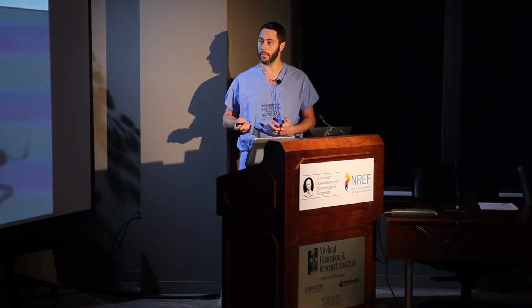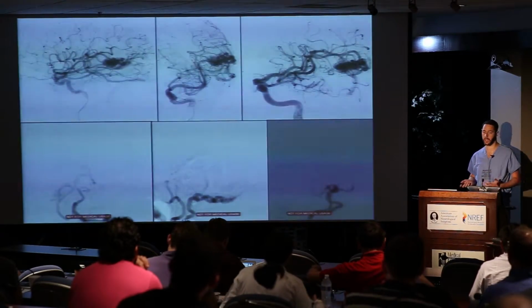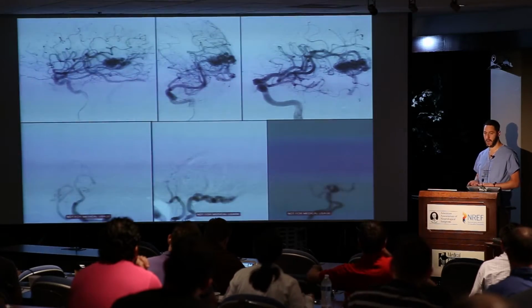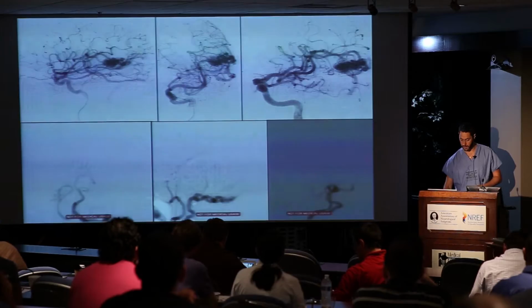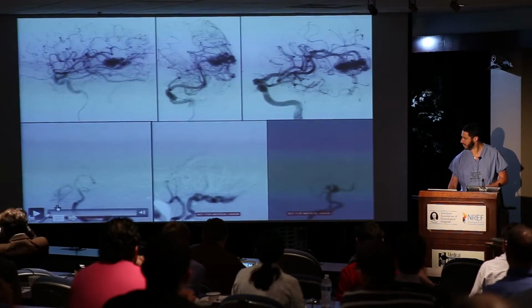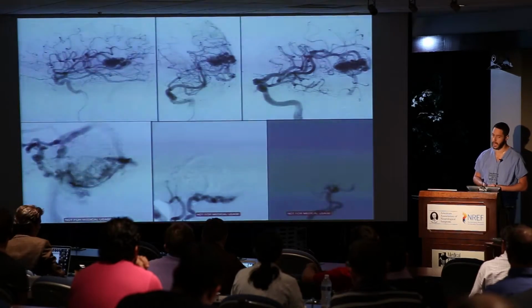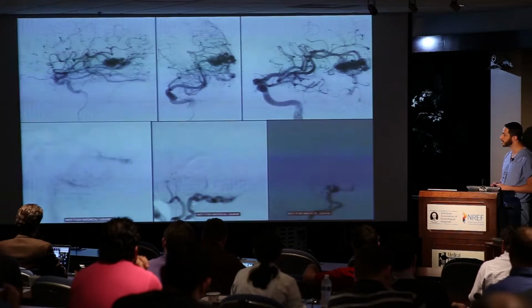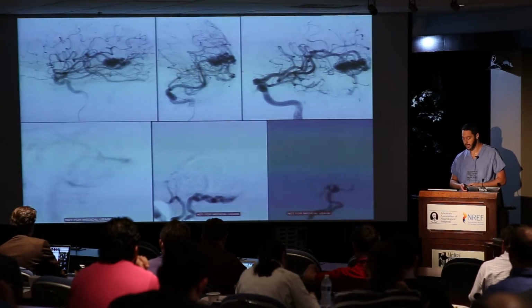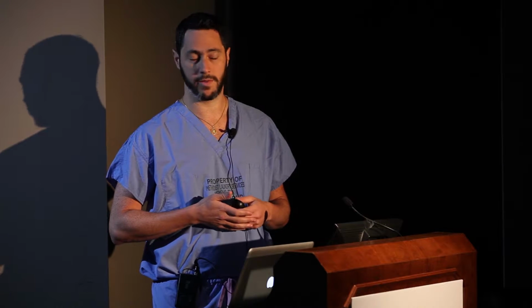Here's a young woman I've seen in my clinic. One of my partners saw her 10 years ago, when migraines led to the incidental finding of this horrible AVM. Here's a vertebral injection: diffuse nidus, PICA and other supply, obviously deep venous drainage. She presented with headache, and 10 years later, she has a horrific hemifacial spasm that doesn't respond to anything else.